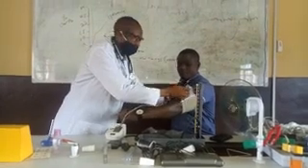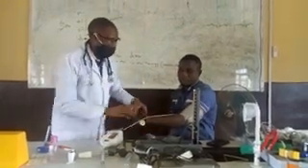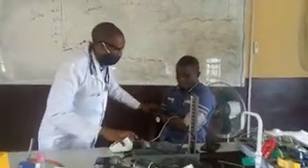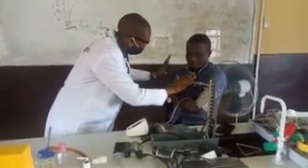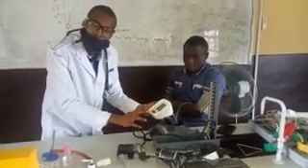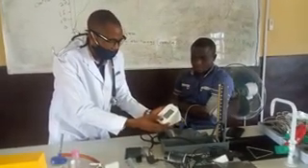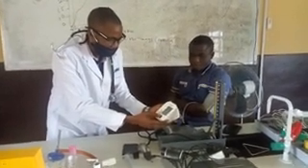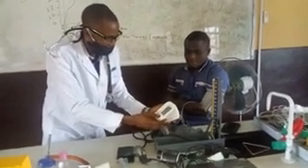You place the cuff on the subject's arm and ask the subject to stay calm — no agitation. Reassure them: it will not hurt you, it will not pain you. The digital sphygmomanometer has a start and stop button. You click on the start button and it will begin reading.